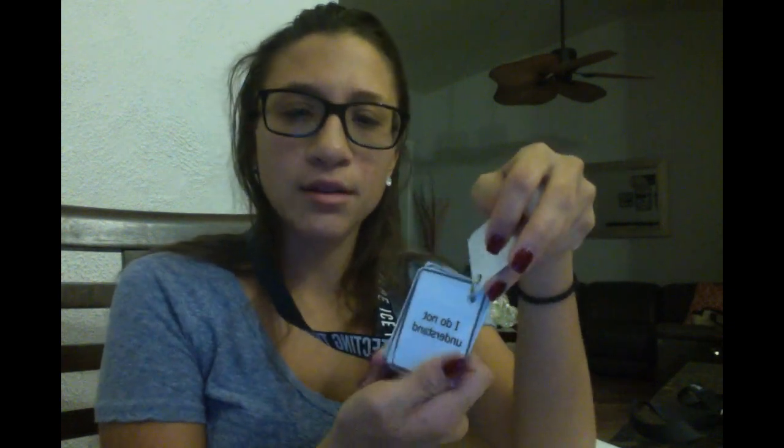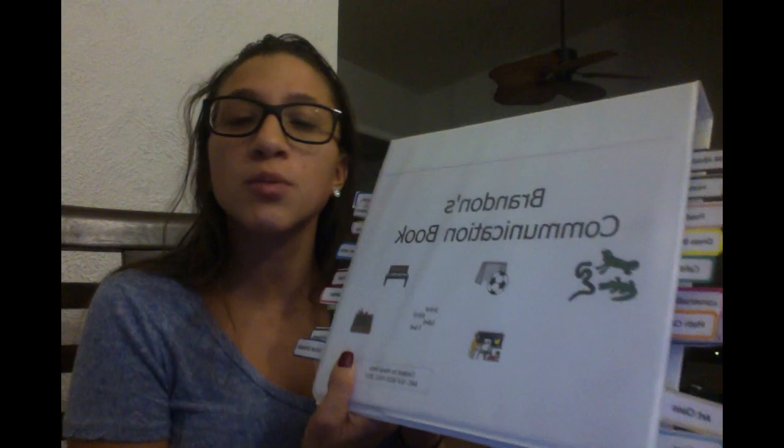And some of the stuff that's said here, he could use in different environments, such as an introduction card that says, my name is Brandon, I use these visuals to communicate. And then it has hello, how are you? Or I do not understand. Or this is fun. Just some quick phrases that he could use in different settings. So he could easily store it in the pocket of his book, and let's say he's in school, he could just leave the book in his locker and then just take his cards with him.